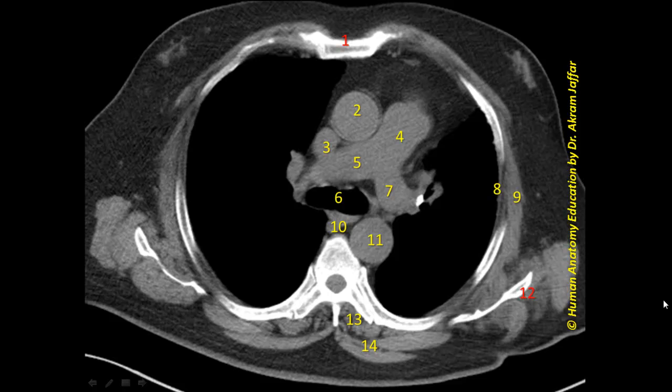In the following list, match the lettered phrases with the numbered structures appearing in the axial CT.